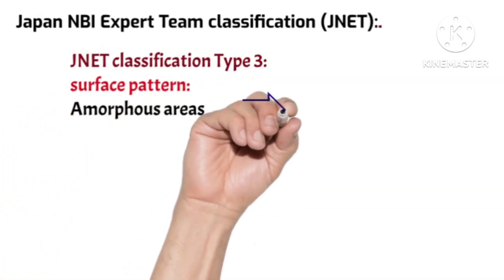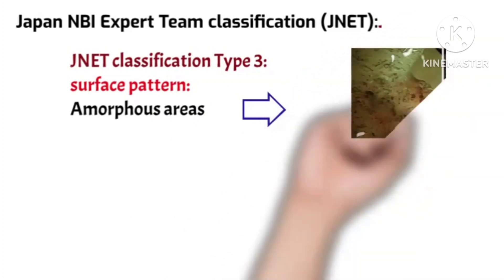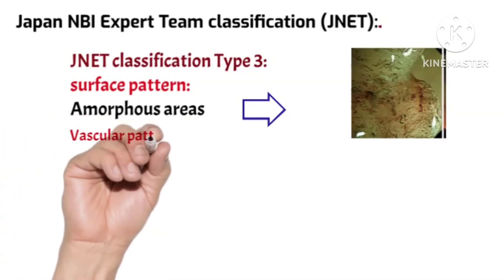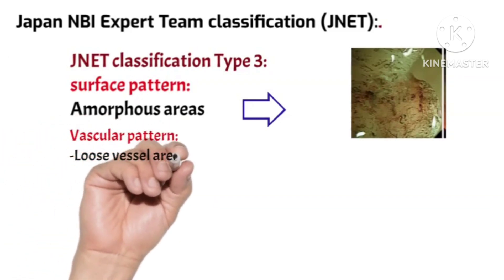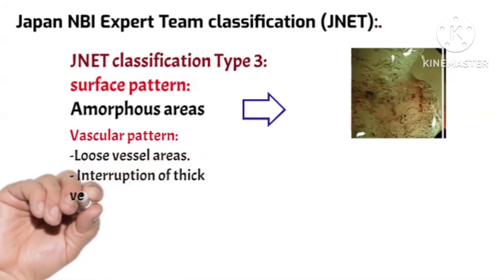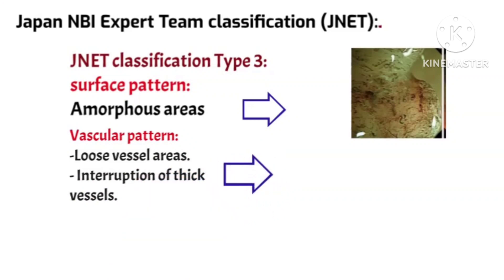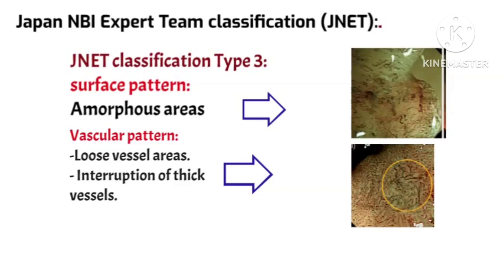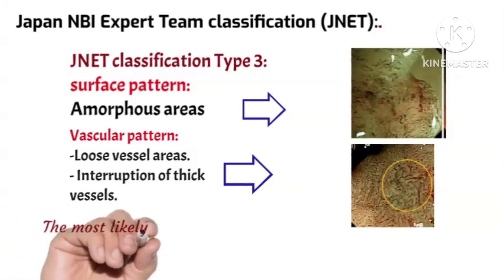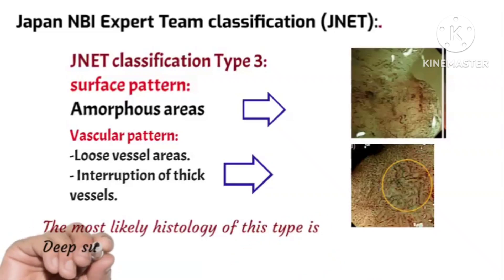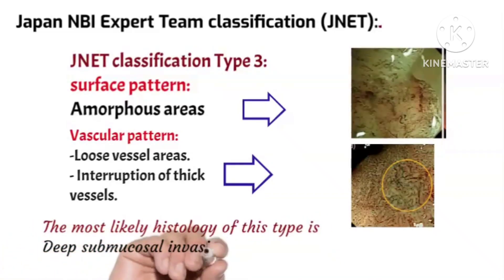JNET classification Type 3 shows a surface pattern with amorphous areas, and the vascular pattern shows loose vessel areas and interruption of thick vessels. The most likely histology of this type is deep submucosal invasive cancer.